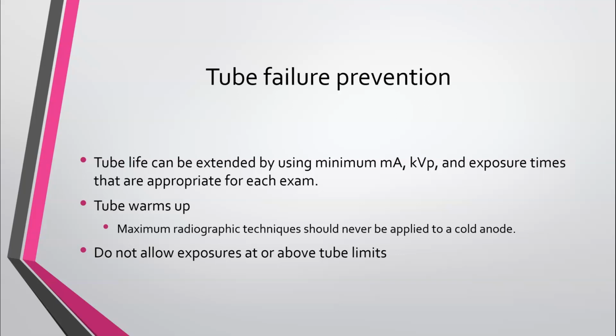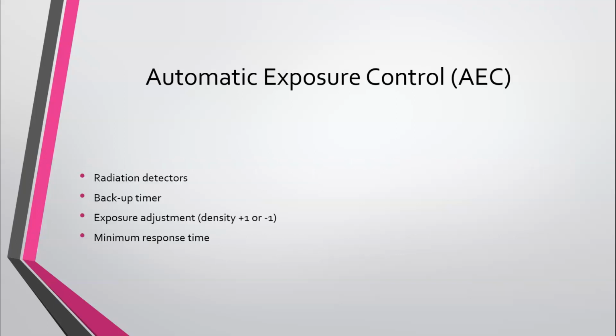So the good news is your tubes will make you warm them up if you haven't done it in a while, and they will not allow you to expose over what is allowed. Now, if you're on a really old unit, they will. So you need to make sure you warm them up and that you do not exceed your exposures.